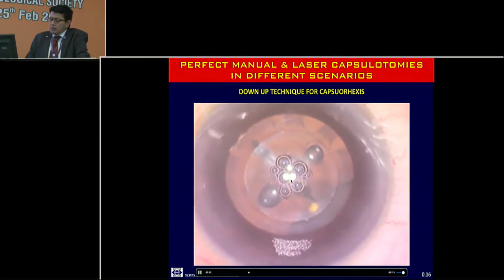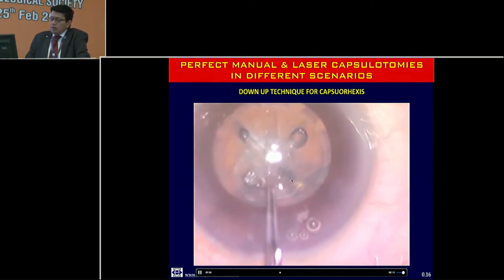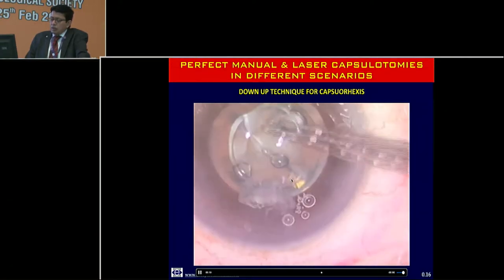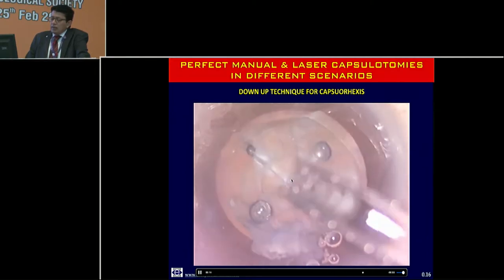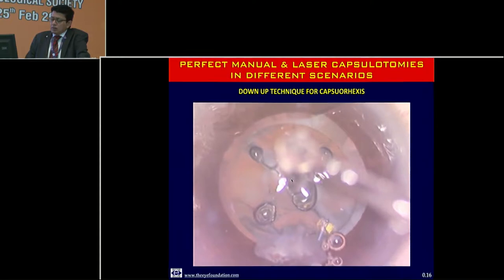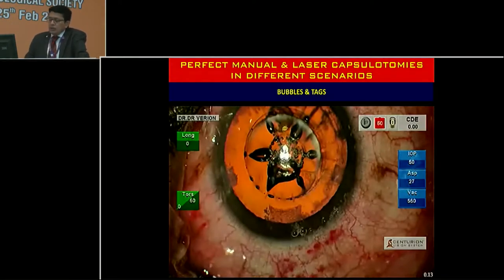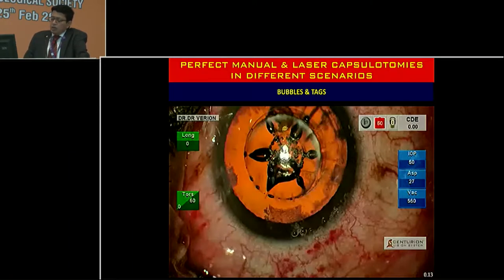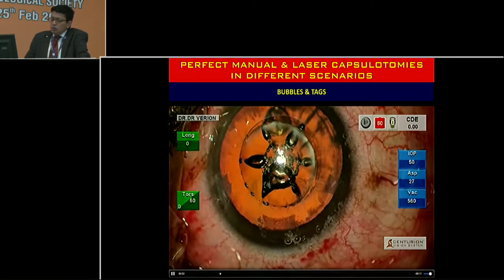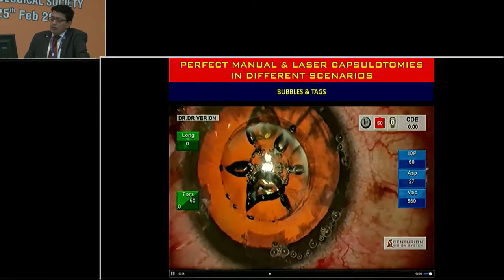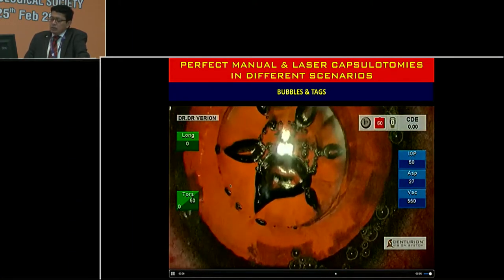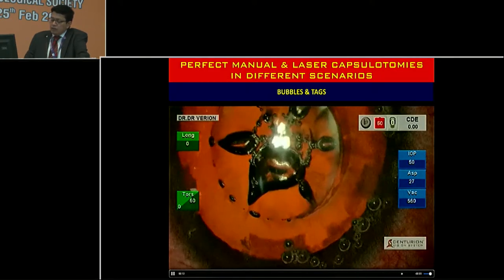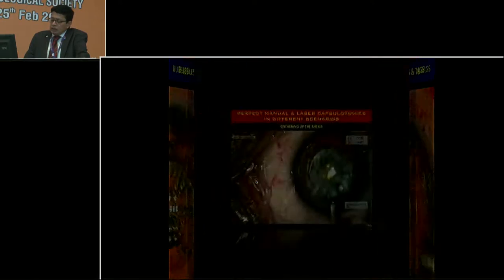More often it's on the surface, in which case I use the down-up technique — going in with the Utrata forceps and picking up the capsule to get a perfect well-centered rhexis. You have to be cognizant that capsular adhesions may not be completely free. In a situation where you see bubbles, the capsule is adherent — if you pull it up with forceps, there could be a rhexis run-off to the periphery. Always have a close look first, and even when everything seems to have gone well, these adhesions are dangerous and you must use a needle to ensure the capsular rhexis is completely separated.